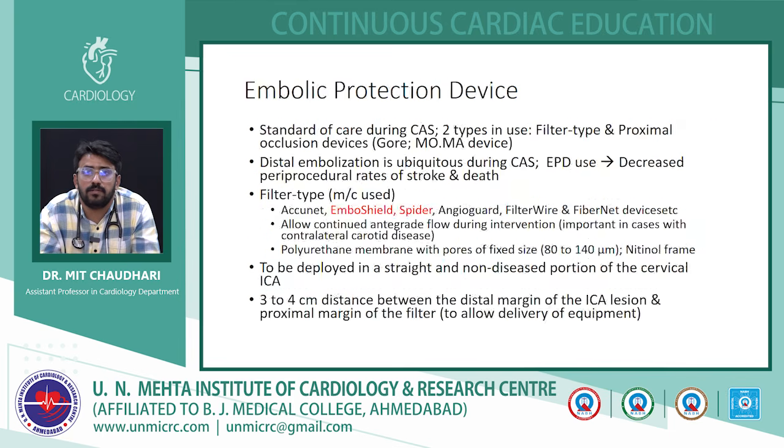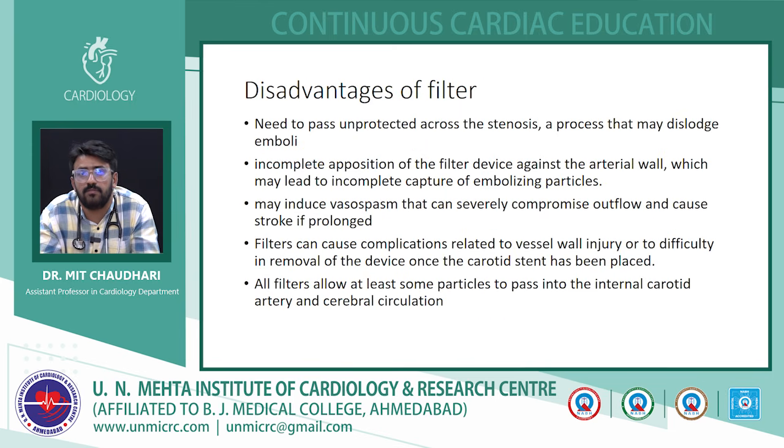As in the EmboShield filter, the filter itself comes with a guide wire, a bare wire. So we first cross the lesion with this wire, then after that we cross the lesion with the undeployed filter. During this portion of the process, the cerebral circulation is unprotected, so the filter or the wire itself can cause some embolization.